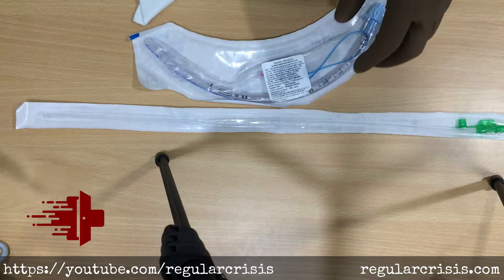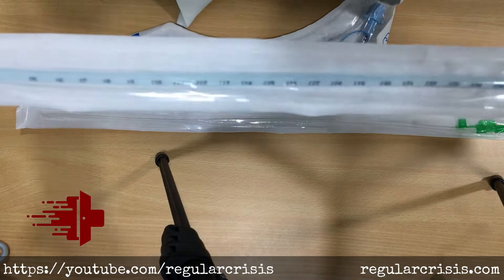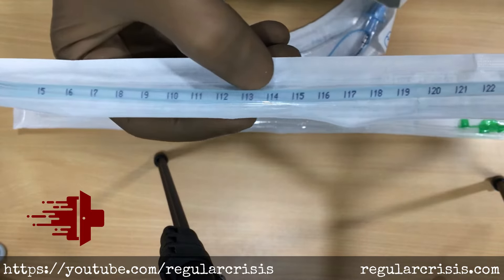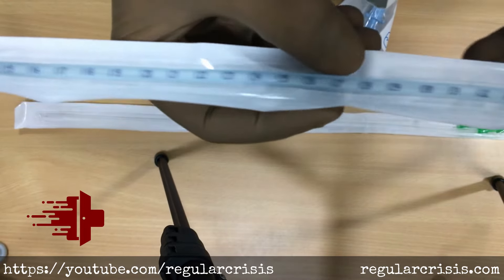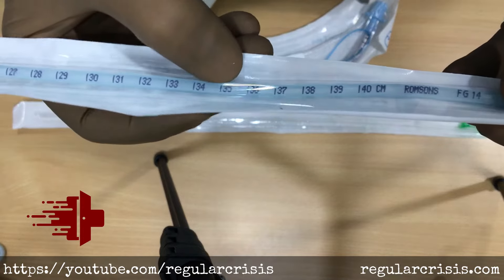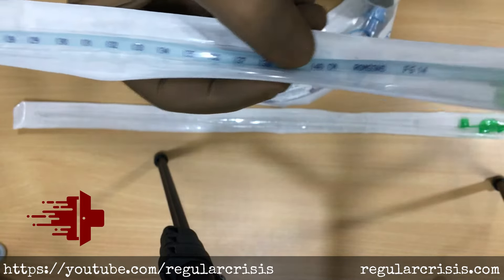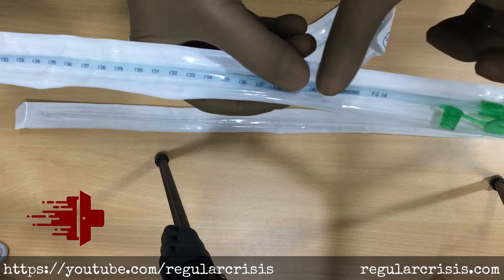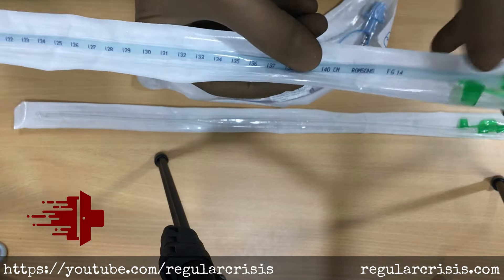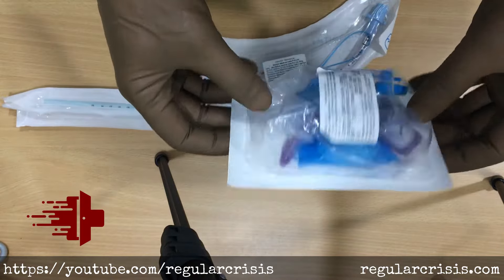Fortunately, we have a suction catheter here that is labeled with centimeter markings — you can see markings at 5, 15, 20, 30, 35, and 40 centimeters. Up to the 35–40 centimeter mark you should insert the catheter, and the remaining portion should be left outside the endotracheal tube.